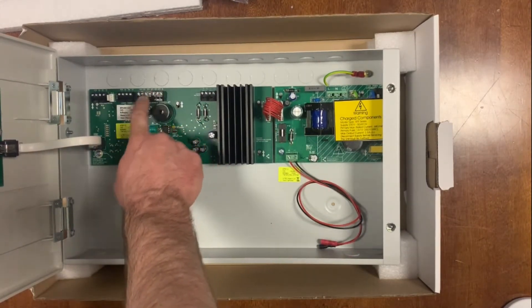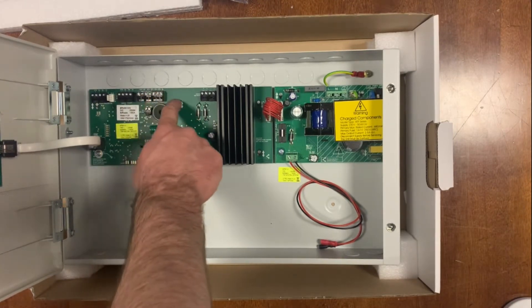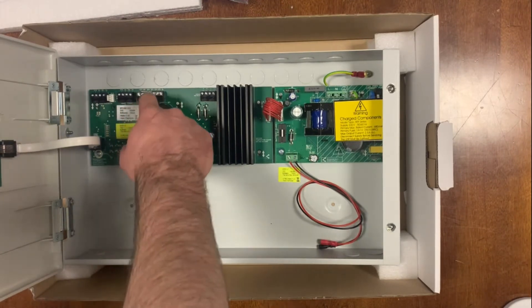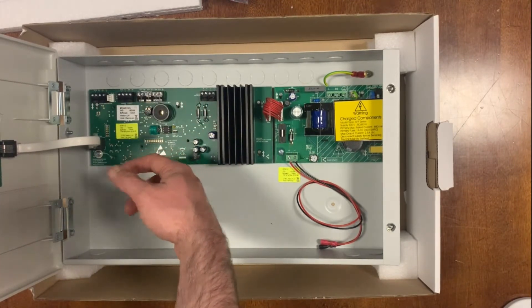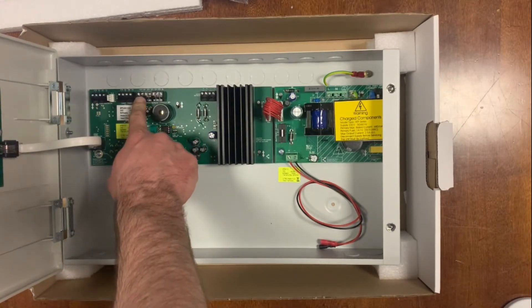You also have a selection of outputs from the panel here. These are open outputs and are somewhat programmable by default. Output 1 is set for nurse call, Output 2 is set for an emergency call — that kind of thing — but you can actually program these.